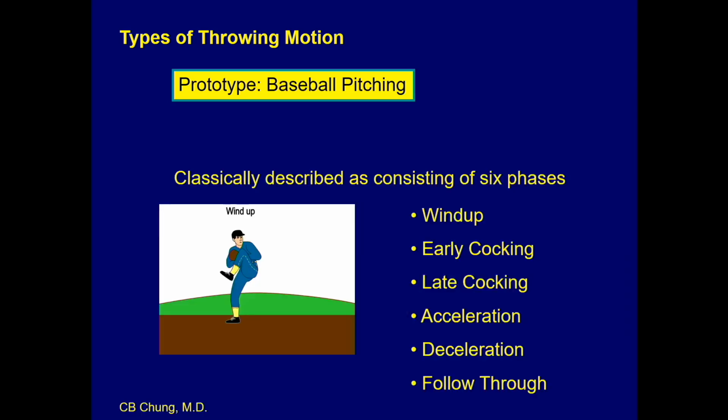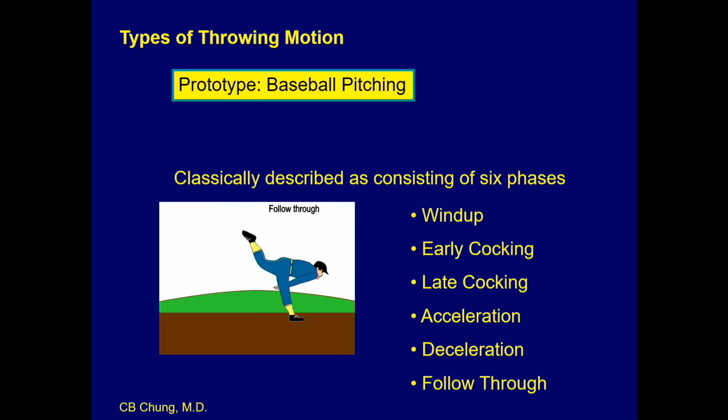If you go into the literature and try to come up with a description of the various stages or phases of baseball pitching, you won't always get the same list that I'm providing you on this particular slide. In this slide, these are the classic stages. So we will talk a bit about cocking phase, acceleration phase, deceleration phase, and follow-through phase. And it's of interest as you look at this, and I'll run through, Christine gave me these images. They go fast, but so does the baseball with most of the current professional baseball pitchers. This is what it looks like in the various phases of throwing.